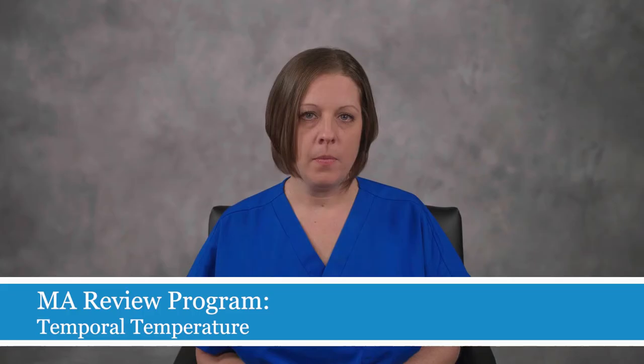There will be a tapping or clicking sound when the temperature has been reached. Release the button and remove the thermometer from the forehead.